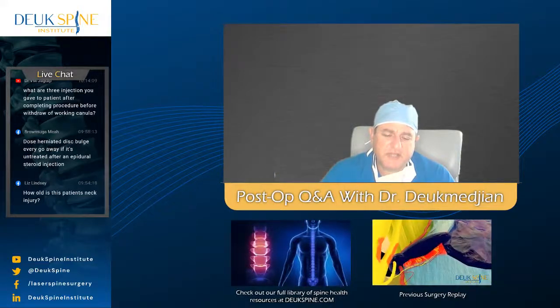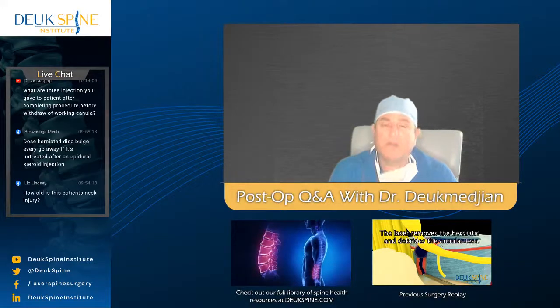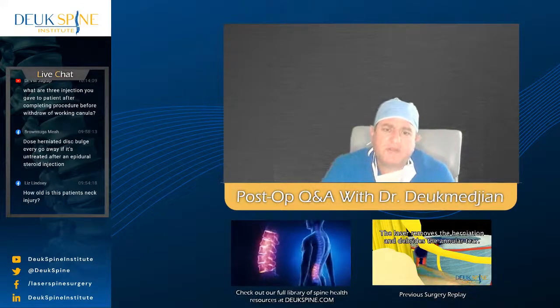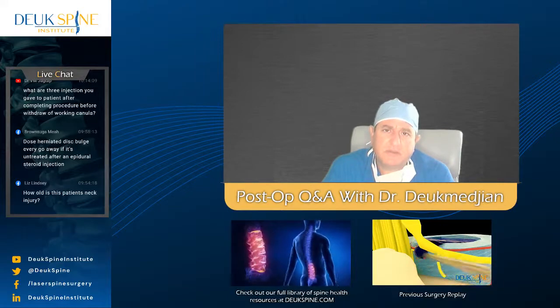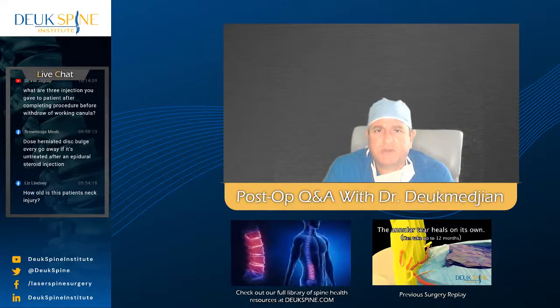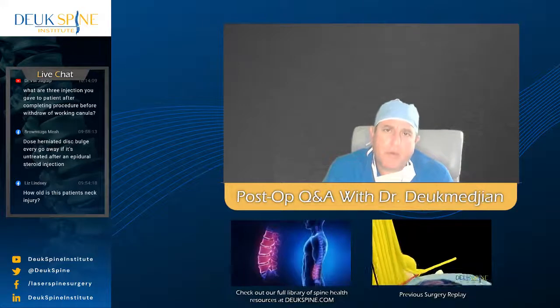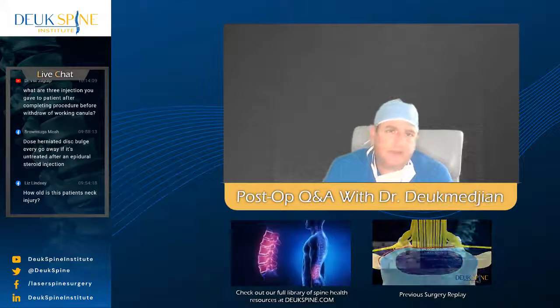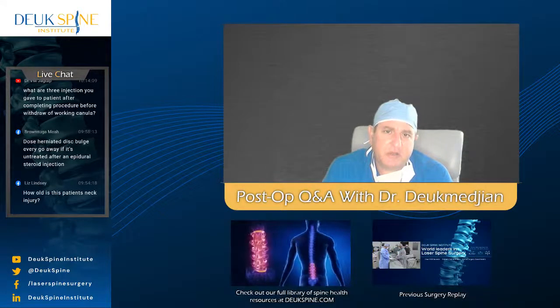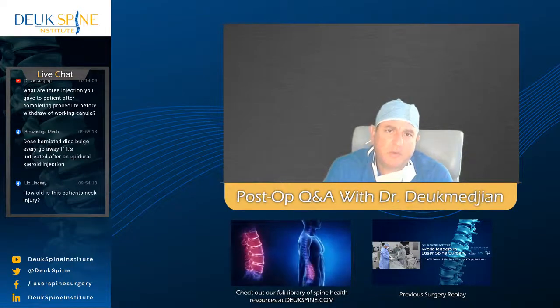So the first injection we do is an antiseptic, and that is something called betadine. Betadine was developed right here at NASA. We're literally 10 minutes from NASA. We're located in the Space Coast of Florida, near Orlando. And betadine is just a great universal antiseptic, topical. You don't drink it, you don't inject it. You basically just let it go into the surgical wound, and then you irrigate it out. So injection number 1, betadine.